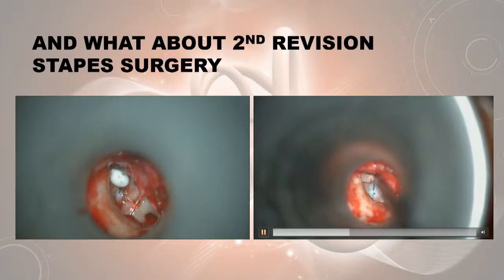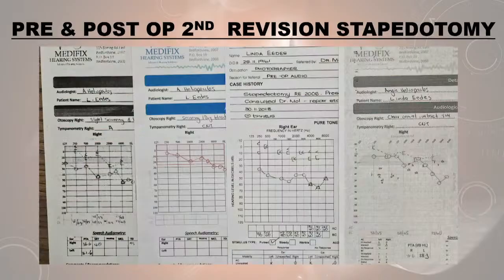So this, again, we learnt, and we then put in our little nylon core on this patient. Just for sake of time, I'm going to move on. And that patient is now still doing very well. So that was the first one, far left. When I first saw them, that was after the first revision.